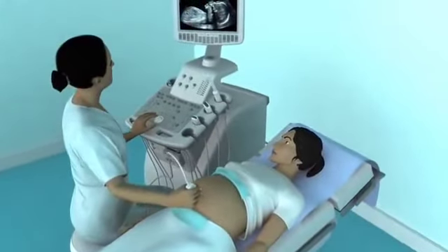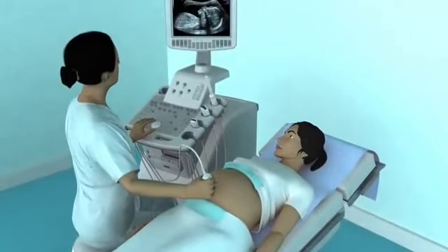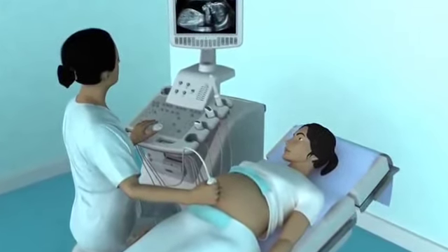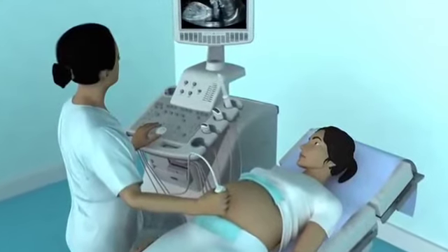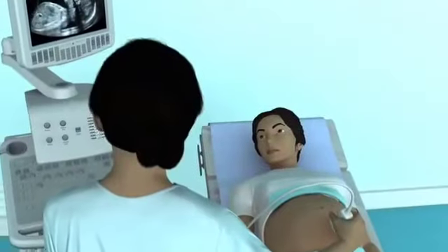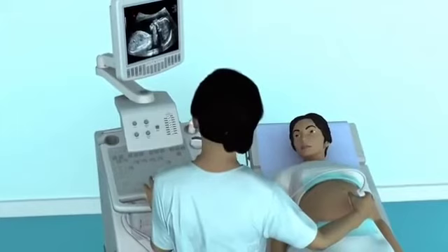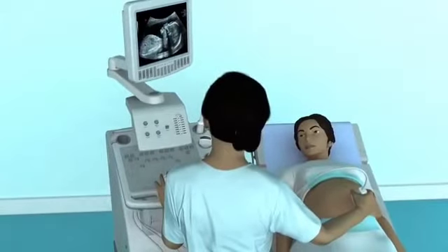This film will show you how to prepare for scanning, how to examine and measure the fetus using both a standardized 6-step approach and part of ISUOG's 20 planes and 2 sweeps approach. And finally, how to provide aftercare for the woman. The examples used will incorporate pregnancies of different gestations to best illustrate the specific steps of the scanning procedure.